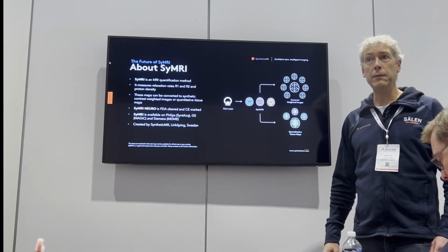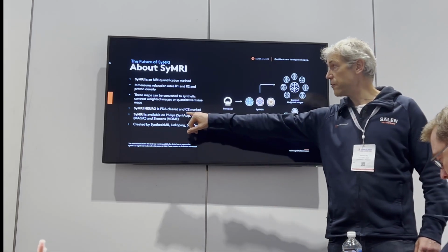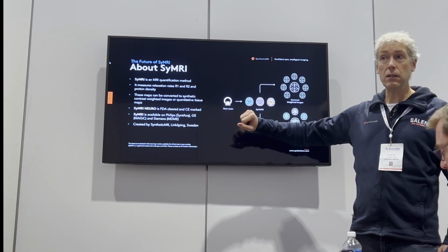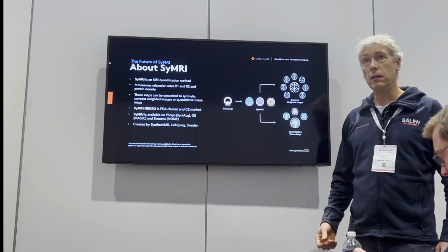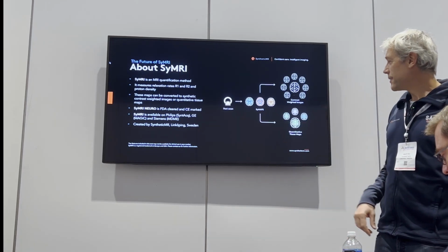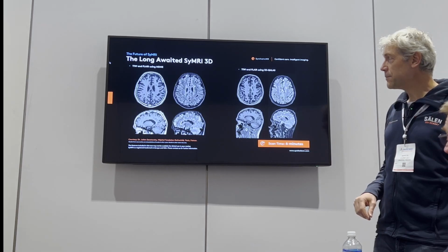Unfortunately, we have a bit different names, which might add to the confusion. But on Philips, it's called SyntAc. On GE, it's presented as MAGiC. And on Siemens, it's MDME, but it's all SyMRI, and created by us.